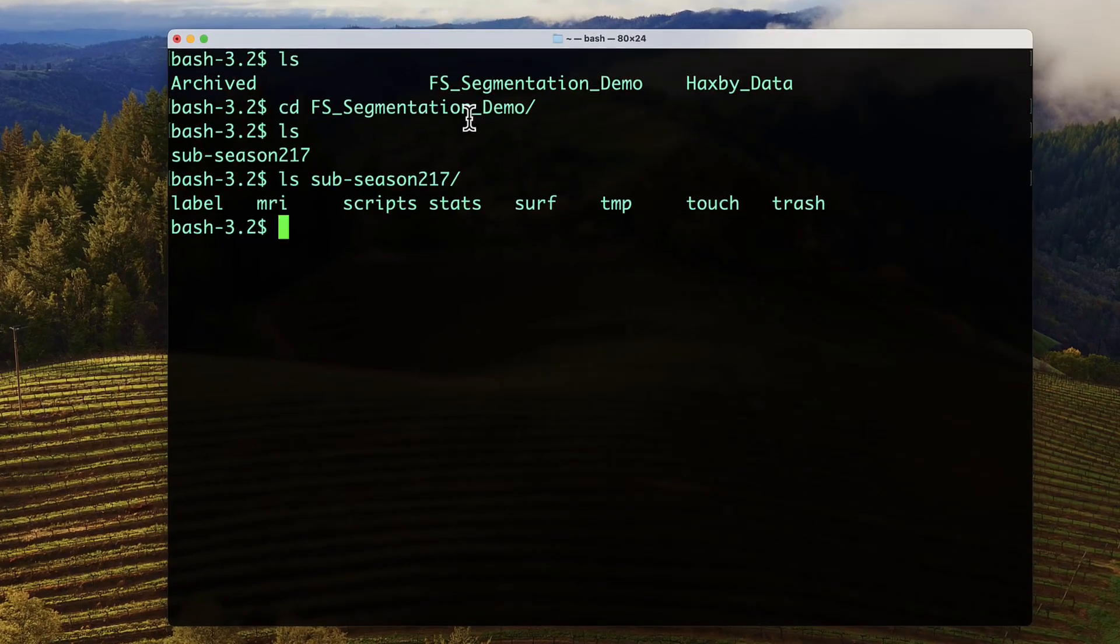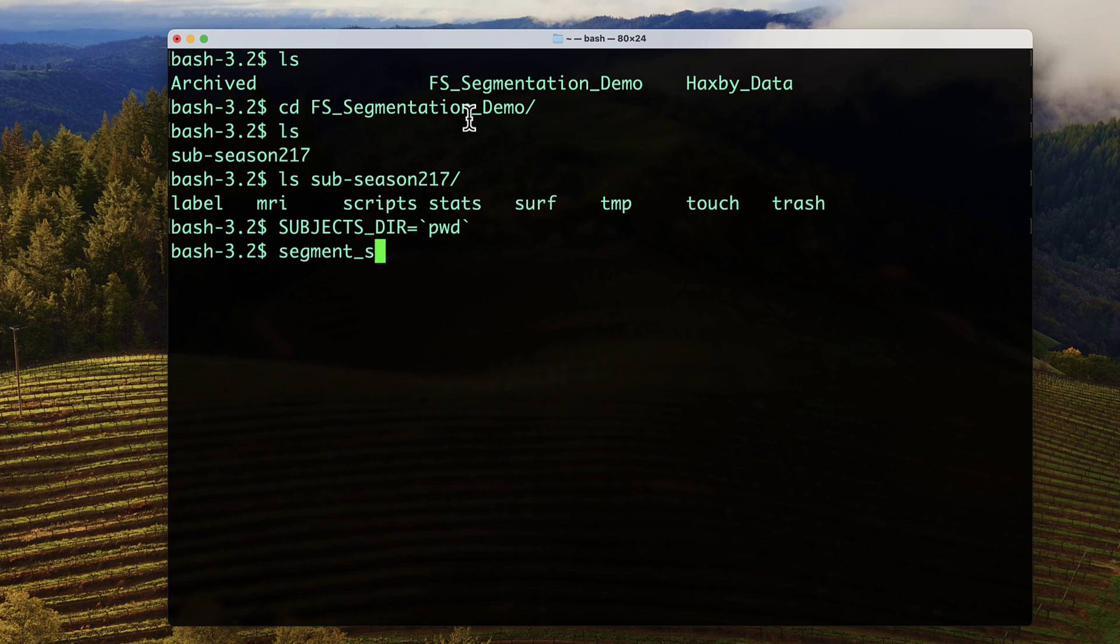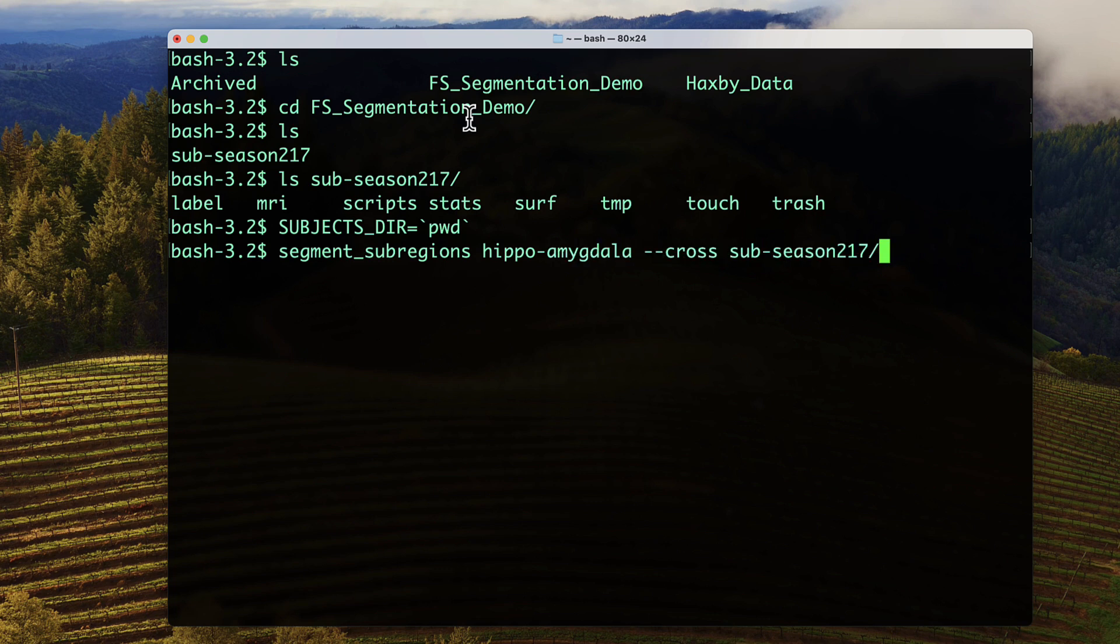In order to do a cross-sectional analysis of the hippocampus and amygdala, from the directory containing your subject, type subjectsdir equals backtick pwd, and then segment_subregions, hippo-amygdala, cross, followed by the subject's name.